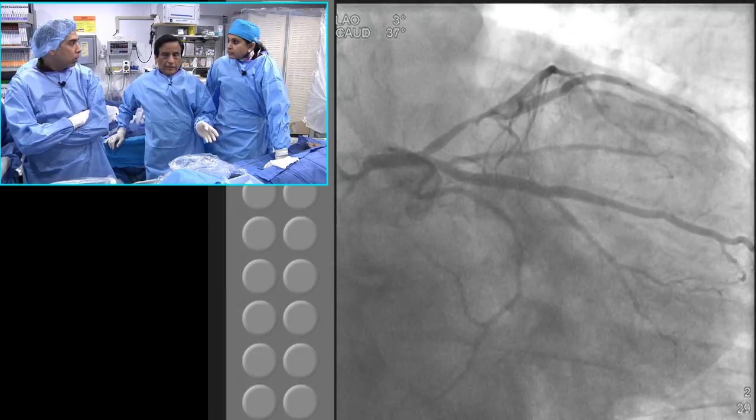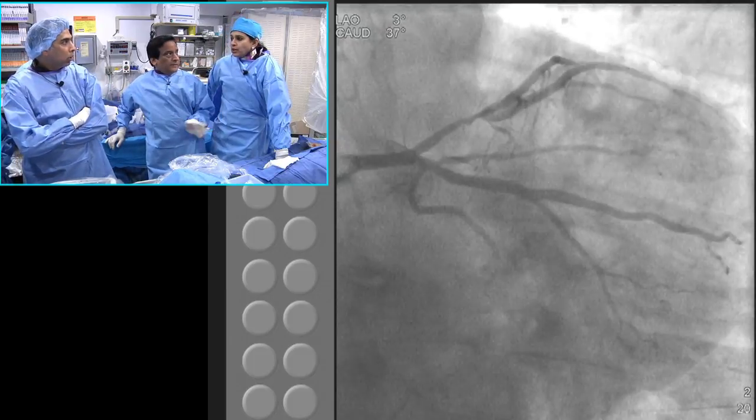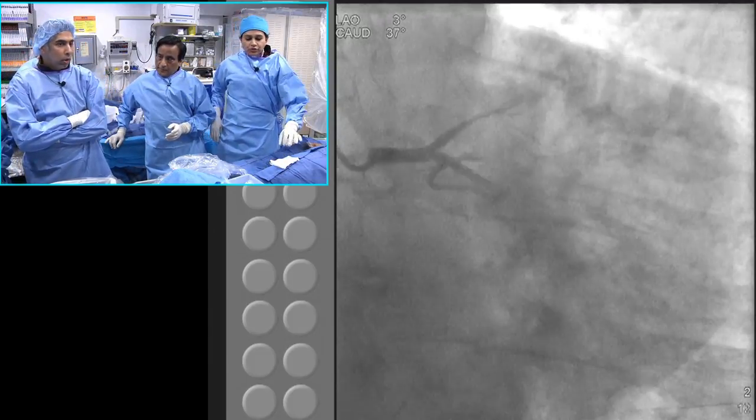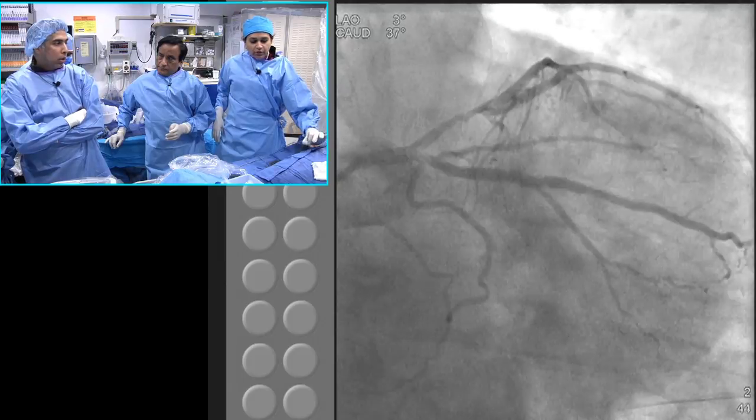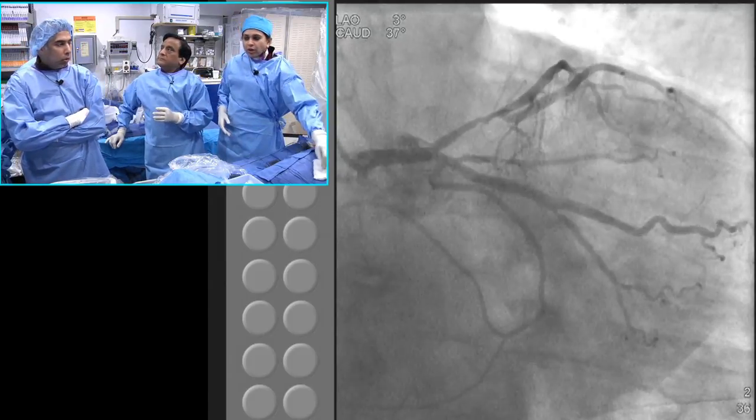We did it during the time of the symposium also, but it is very stiff. So I would not recommend it. More important, it's very painful to the patient. Has a lot of pain. And if there is any movement, moving the guide is a direct contact with the skin of the patient. So we have gone away from that.